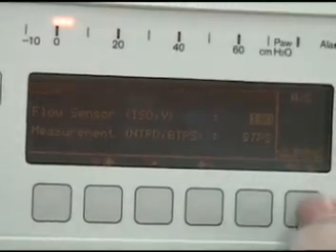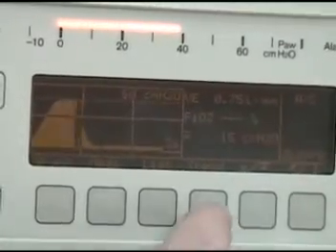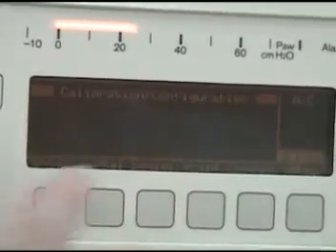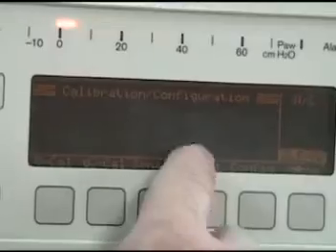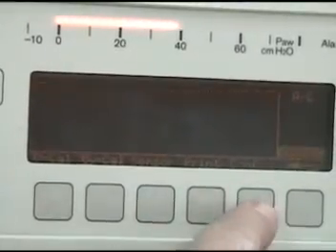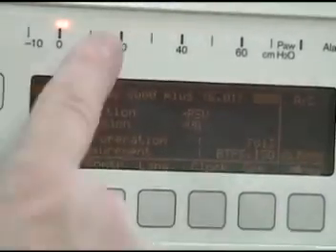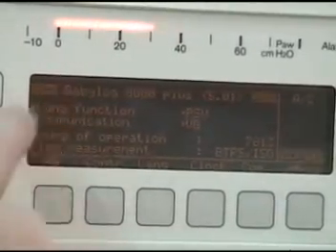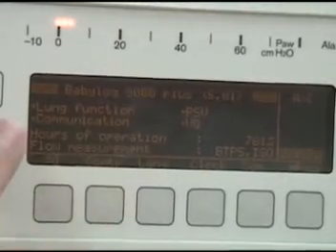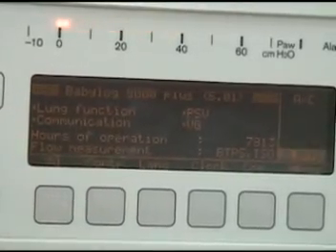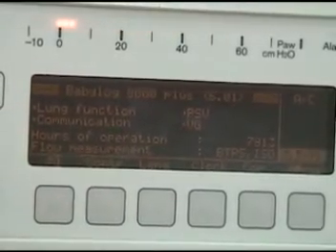We can leave that. If we wanted to print this information, we could do that. The configuration information of the ventilator is available as you see.